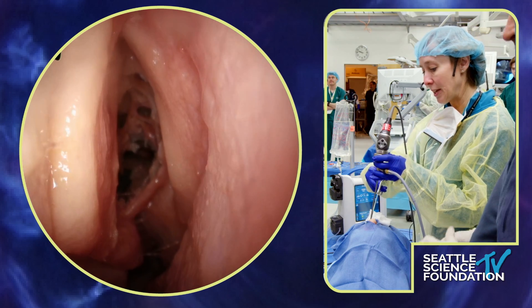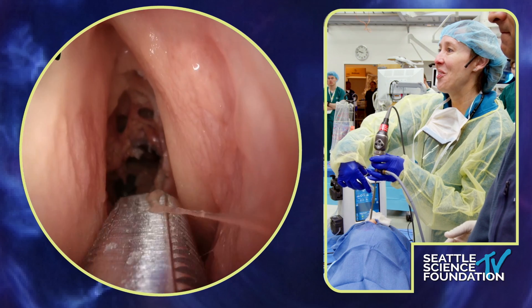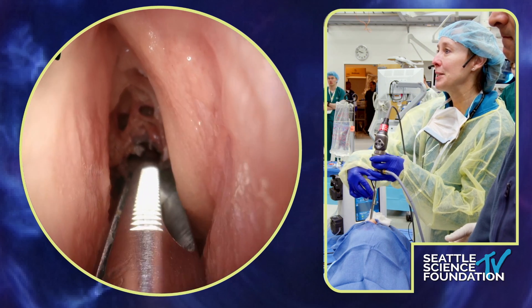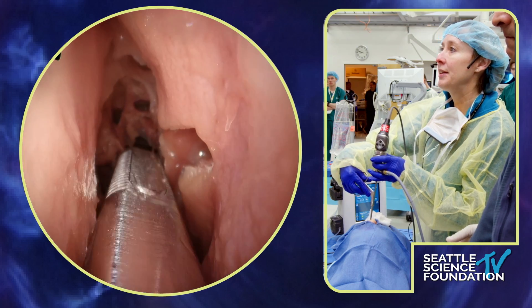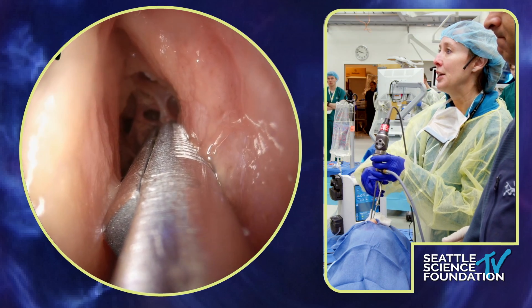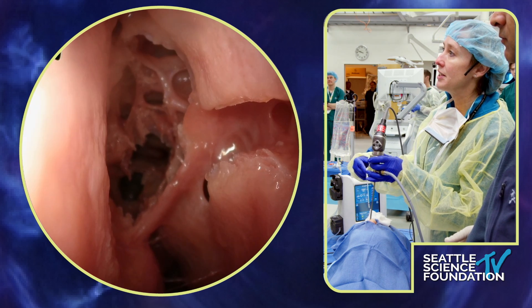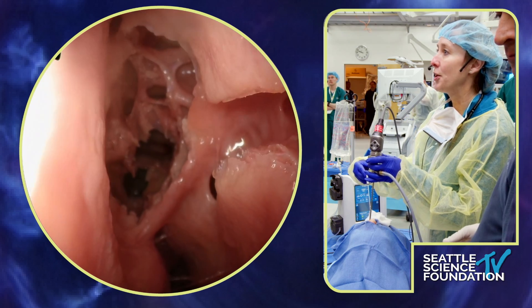Normally I use a pediatric backbiter just because it's a lot more delicate. I like all of my instruments to be small, but because we've done the ethmoidectomy here we can actually use a regular side biter. I'm just pulling that uncinate into the nasal cavity so that I'm not scraping the undersurface. You can see that's the edge of the uncinate and I can actually even start to see the natural ostium — and this is just a zero-degree scope.